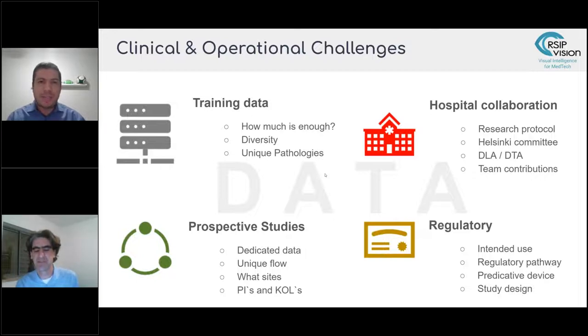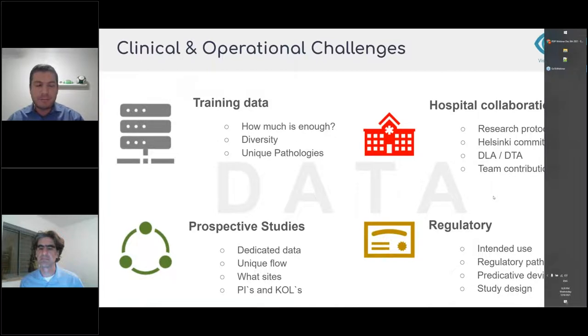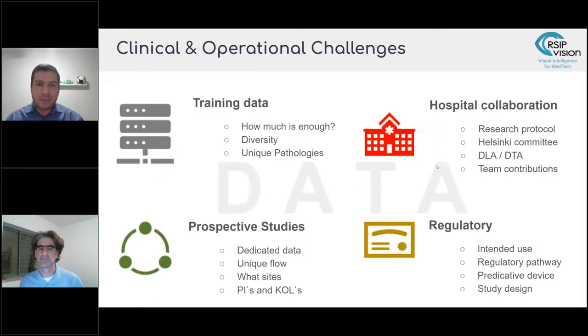And when we talk about data, there are many aspects within the company that need to be recognized and handled and managed all along the R&D phase and even after that in regards to the data requirements. We'll review a few of these in these two, three slides. So we can see here that I divided it to a few different sectors, starting with the training data. That's the basic data that we gather to start the development with and base most of it on top of it, at least at the initial phases.